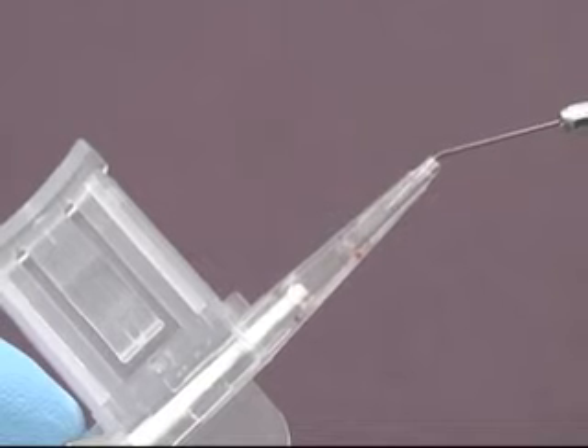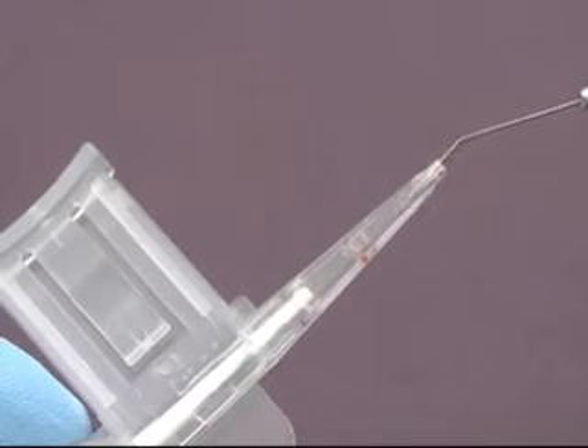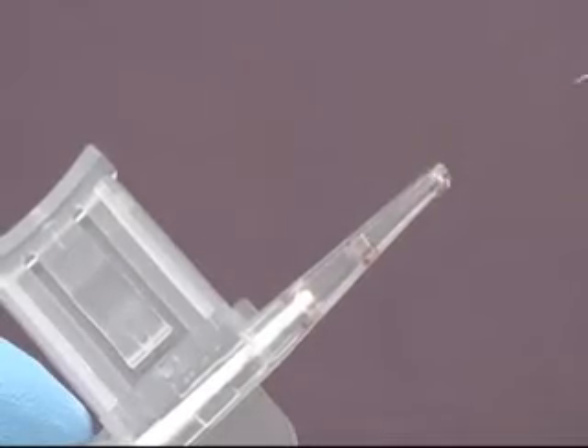Finally, fill the cavity of the tip with AmVisc Plus to avoid introducing air bubbles during the insertion process.